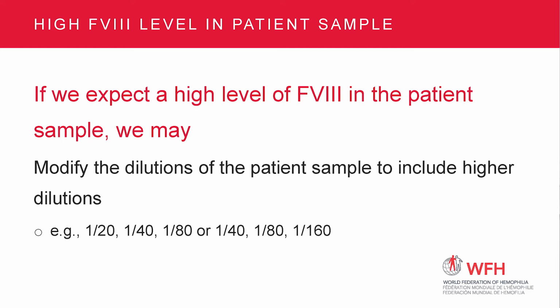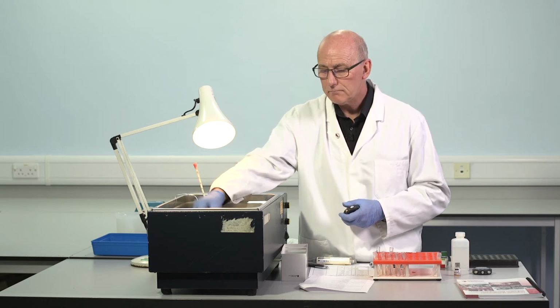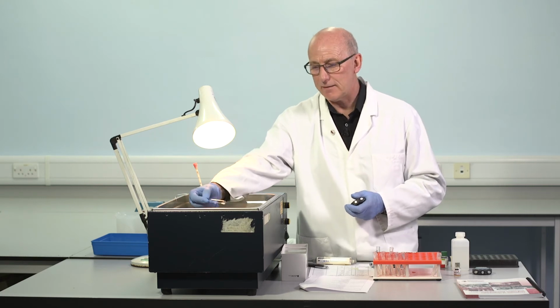So we might test such a sample instead of 1 in 10, 20, 40, we might do 1 in 20, 40, 80. We might do 1 in 40, 80, 160, for example. So the aim would be to produce, where possible, clotting times on the test and QC materials which sit, where possible, within the range covered by the standard.